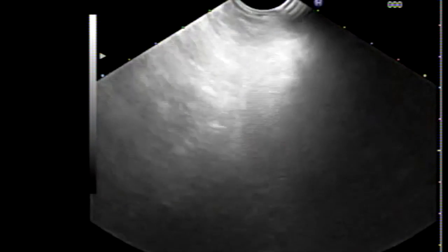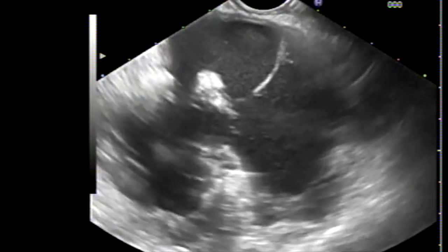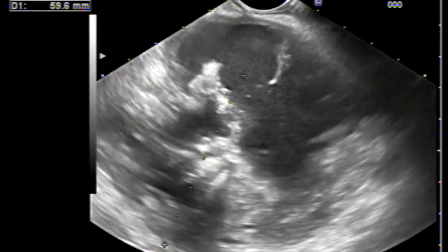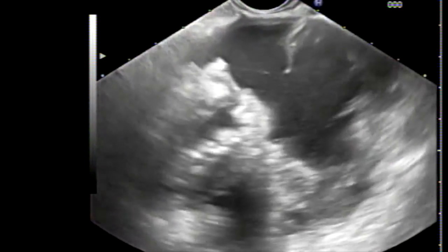Now I will show you the new and easy way of doing it — using a lumen-apposing metal stent (LAMS) with hot current. Here we have another complex pseudocyst, up to eight centimeters in diameter.